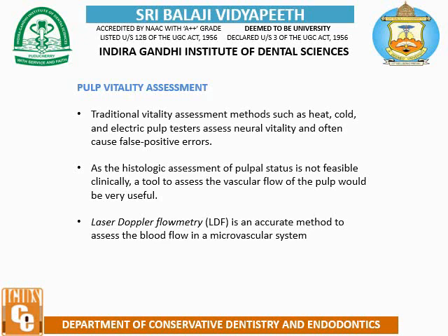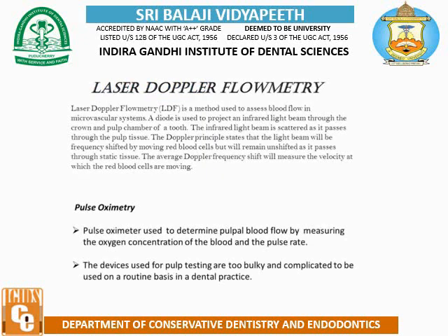Laser Doppler flowmetry is an accurate method to assess blood flow in the microvascular system. A diode is used to project an infrared light beam through the crown and pulp chamber of the tooth. The infrared light beam is scattered as it passes through the pulp tissue.